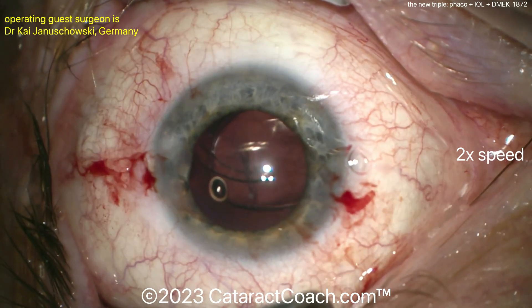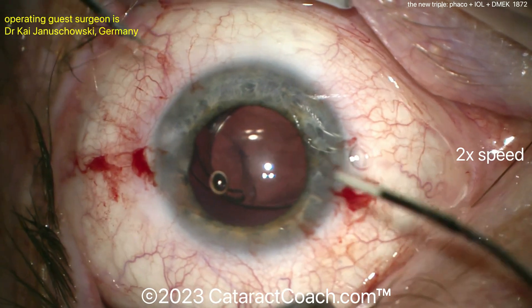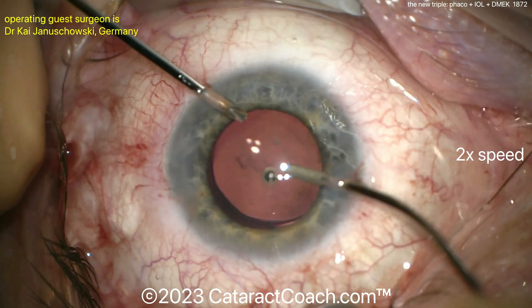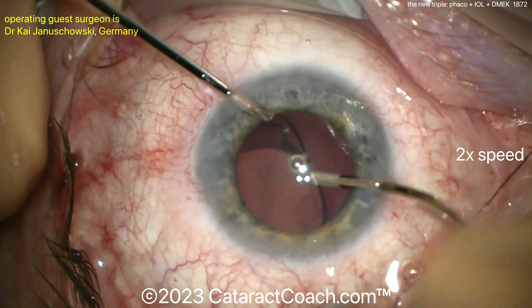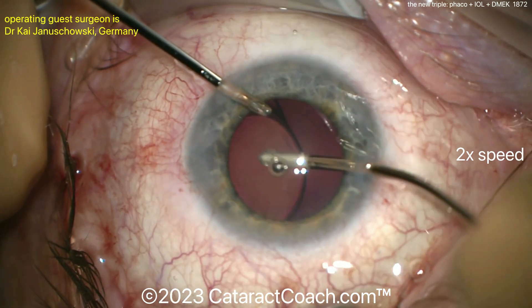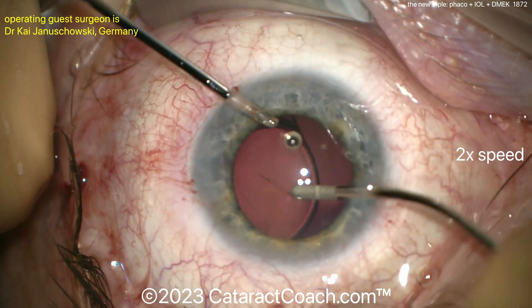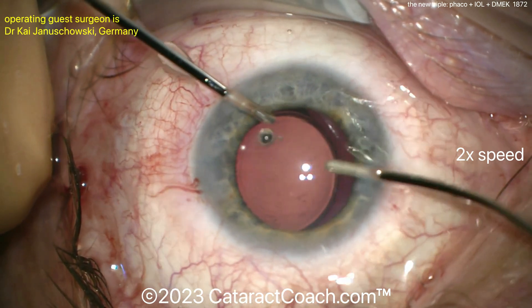Here the IOL is being put in the capsular bag. A single-piece acrylic is a good choice. Usually in these patients with corneal issues, monofocal lenses tend to be the best — toric or not. But here, removing the viscoelastic from the eye and getting that out completely. Now it's going to be time for the DMEK procedure.